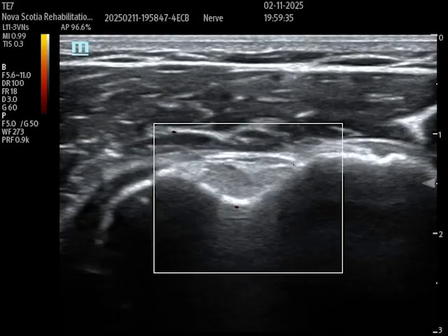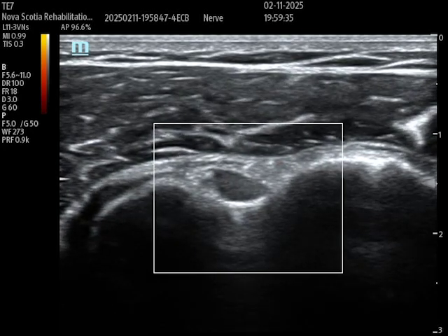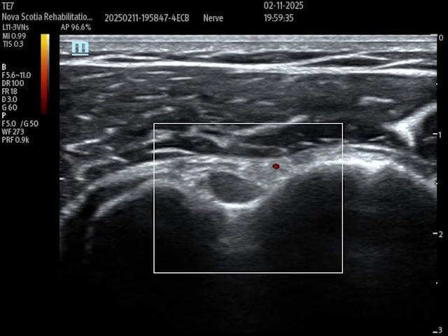Here I've flipped the orientation of the probe and turned on Doppler so you can see the blood flow of the circumflex artery — that pulsatile flow. It's labeled here. When you're doing your injection, you want to make sure you avoid this vessel. We typically find it on the lateral aspect of the bicipital groove. Note that left and right have been flipped on this image compared to the previous ones.